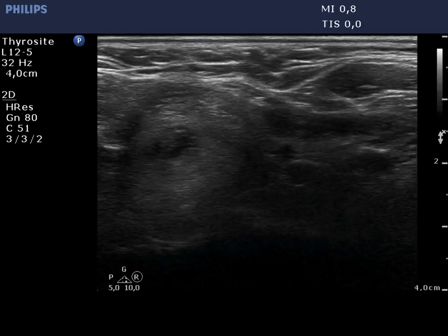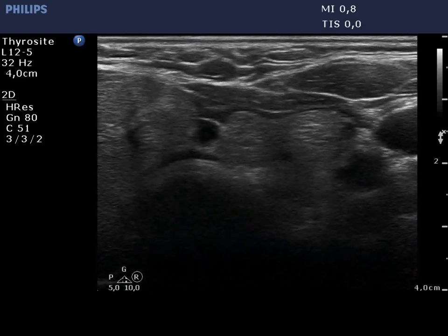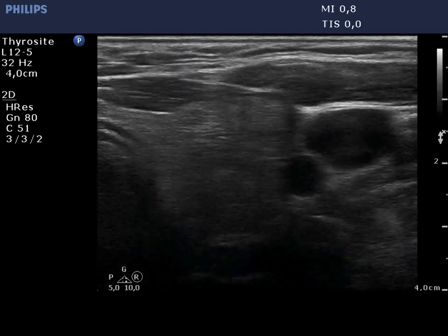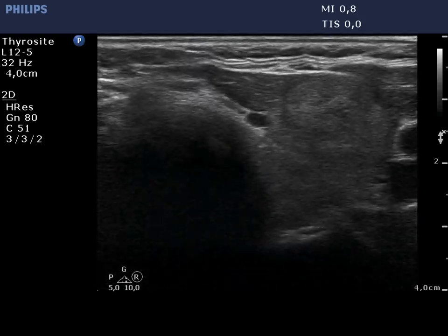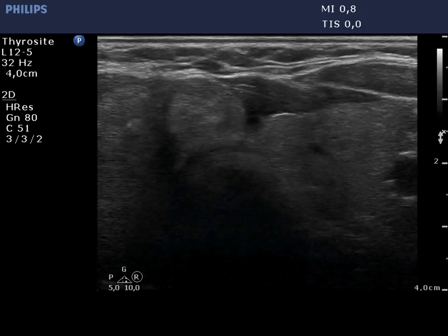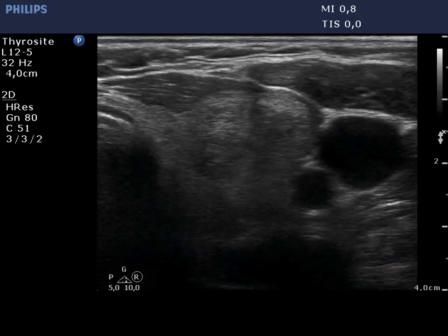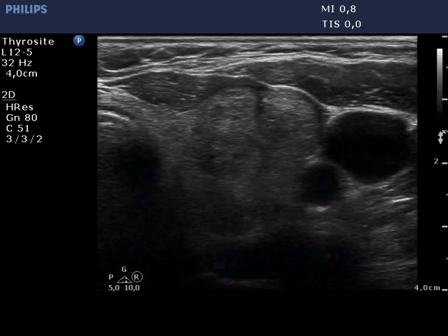The left lobe has a similar appearance. In the pseudonodular form of Hashimoto's thyroiditis, the thyroid is usually enlarged. In pseudonodular pattern, almost the entire thyroid is involved, while in multinodular goiters, a relatively great proportion of the thyroid is non-nodular.